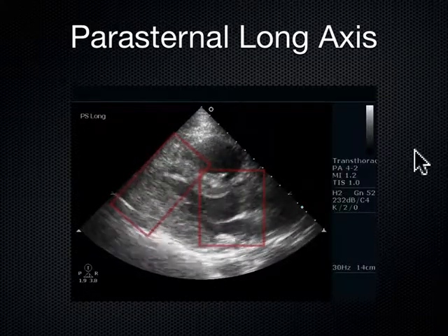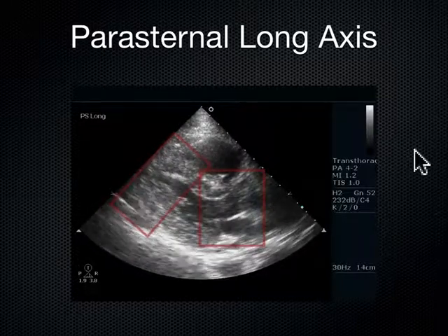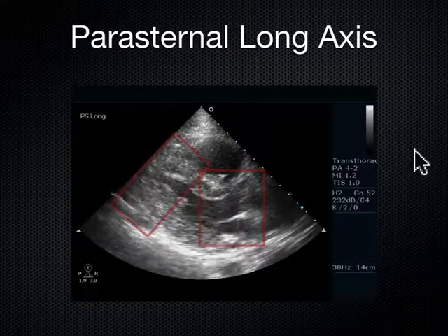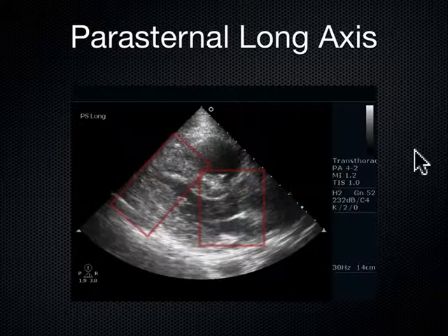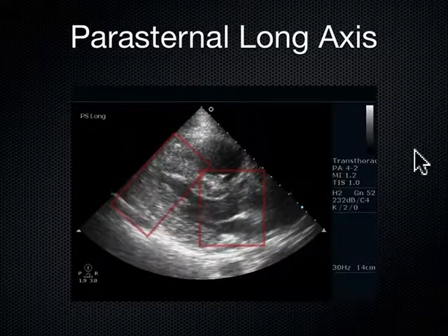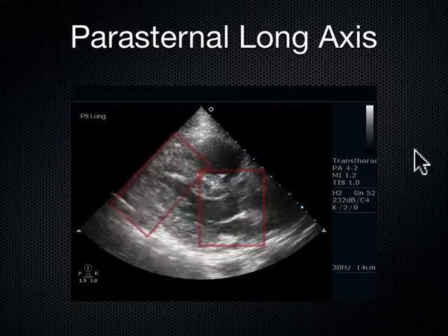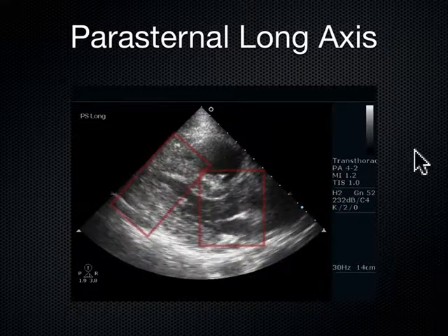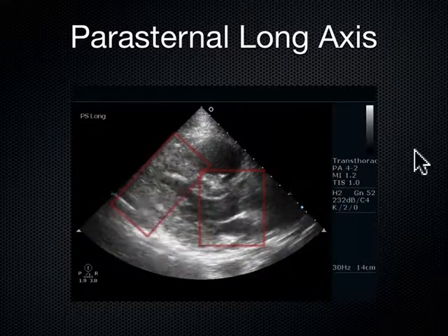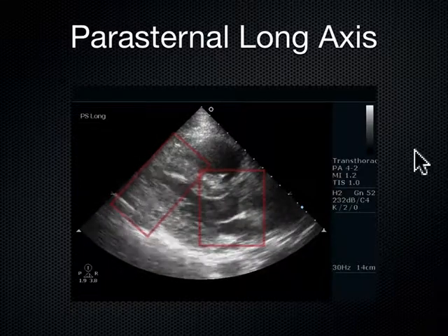So how do we know that this is really, I mean, we've got this long axis through the heart. If I fan the sound from one side to the other side through this cylinderish, cone-ish thing, maybe I'm just shortening my view of the axis, right? Well, if I can see the mitral valve on the screen, I'm pretty much at the midpoint of this person's heart. It's a good question. I'm not off to one side or the other. I'm straight down the exact long axis of this heart.